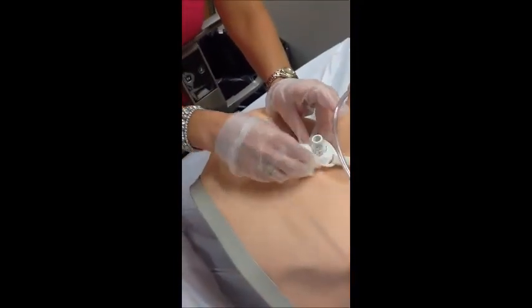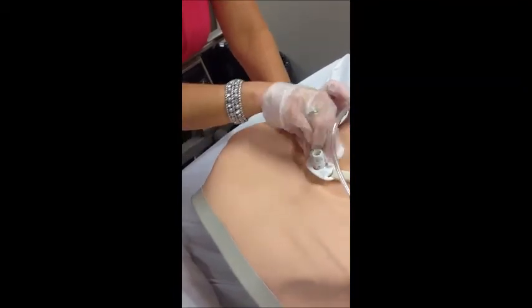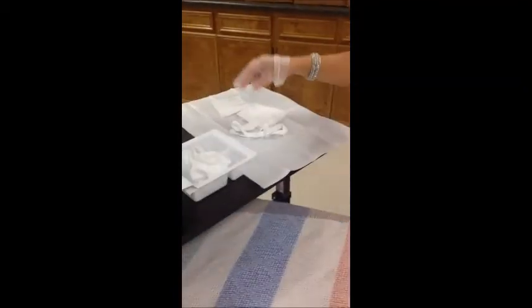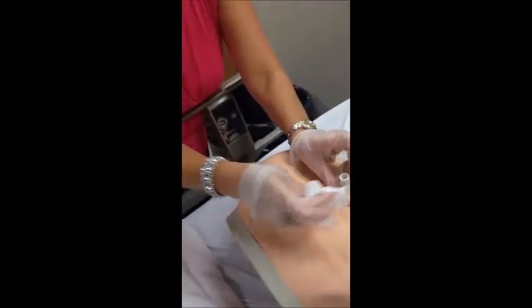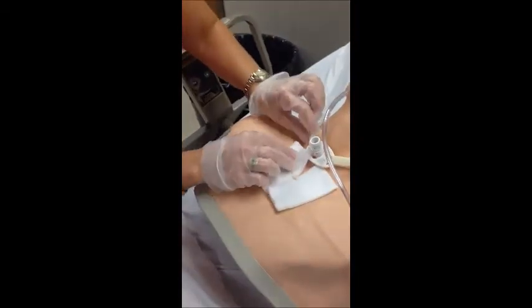Got it squeezed out. It's not, you know, too wet. Faceplate's getting a good cleaning. Okay, now I'm going to dry. Dry my faceplate, dry up under here, dry behind here. Do the best I can to dry. Okie doke. Now, I'm going to put me a new one of these split gauzes under here.